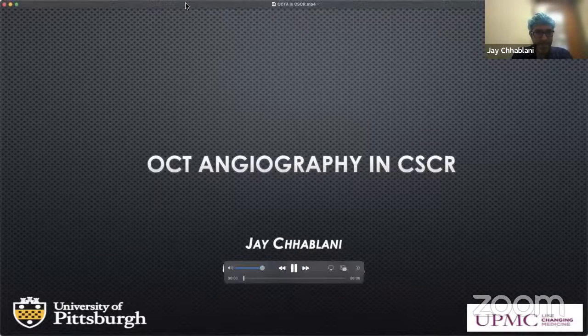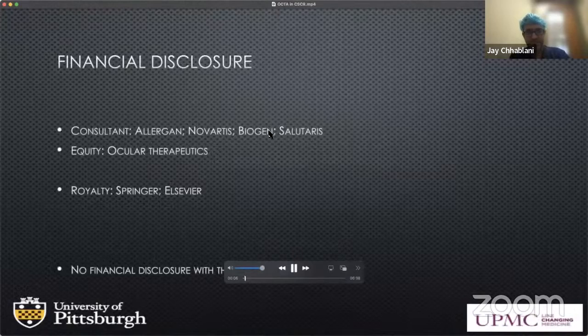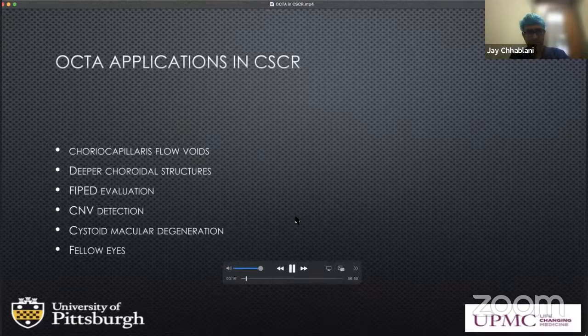Everybody, I'll be talking about OCT angiography in CSCR. These are my financial disclosures, and none of them are relevant to this presentation. I'll show a couple of examples where OCT angio could be useful in cases of CSCR.